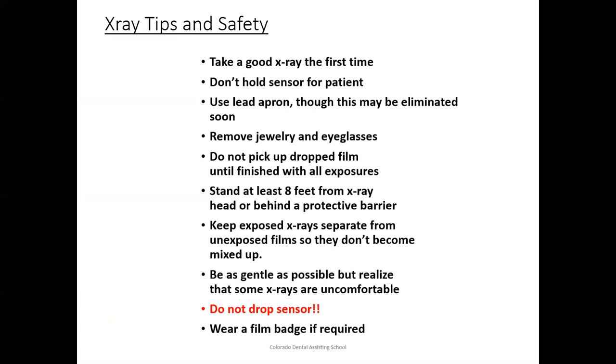Don't hold the sensor for the patient. You always use a lead apron. Even if someone says, oh, you know what, we have this new system and you don't need it anymore, a lot of times patients are going to ask for it because we've been using it for so long. Remove jewelry and eyeglasses. Do not pick up dropped films unless finished with all exposures.